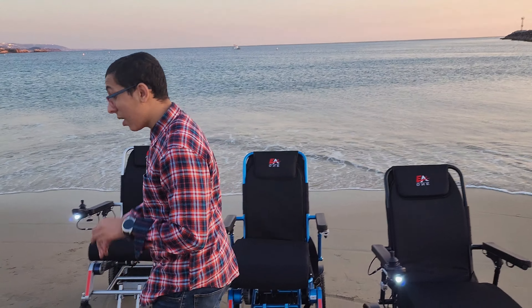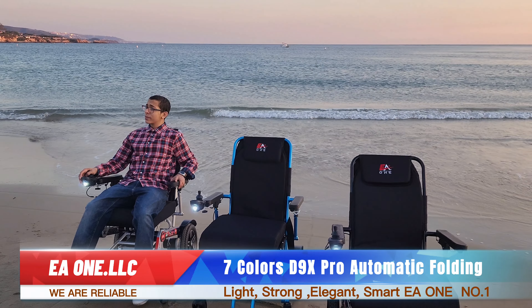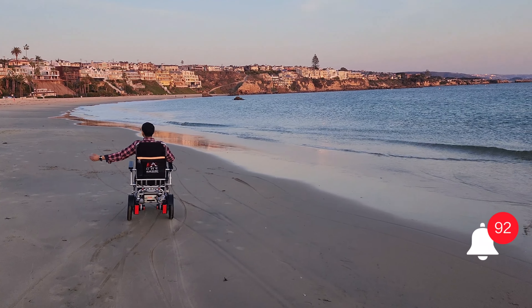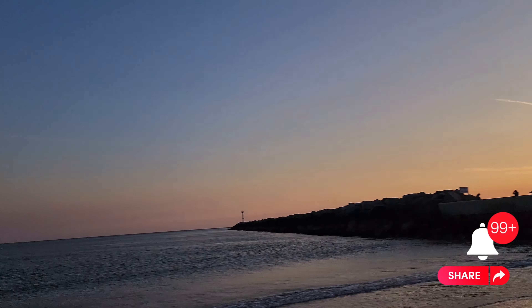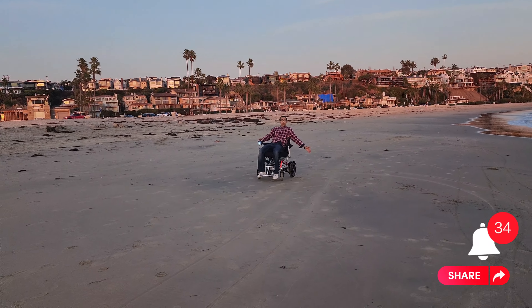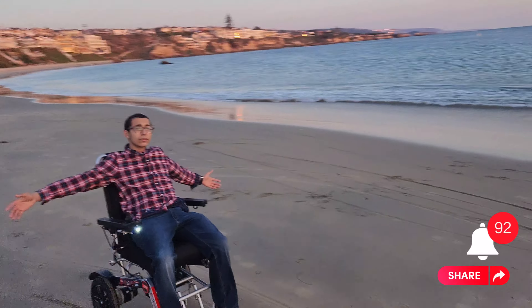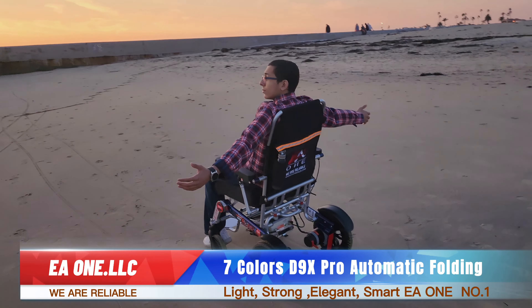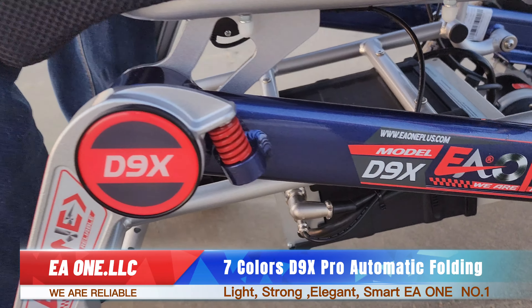I'm going to be testing it on solid sand right now. It easily goes on. EA1 is number one. Let's go.